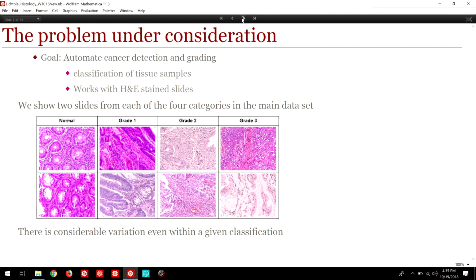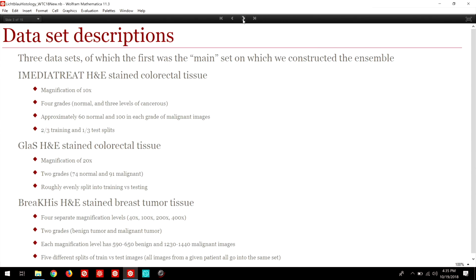So in this data set the light and the instrumentation were similar for the normal tissue and some parts of the cancerous ones. Every time, there are tissues that resemble each other very much in light between normal tissue and cancerous tissue.